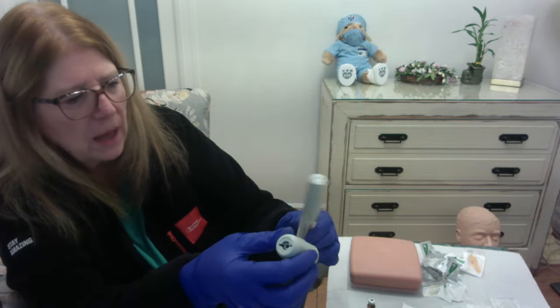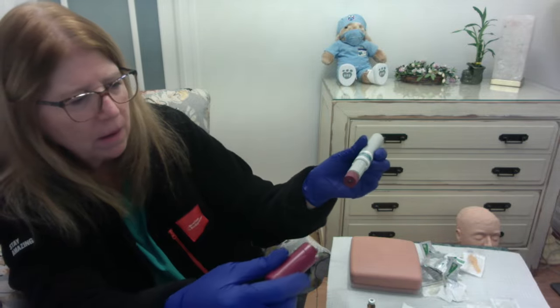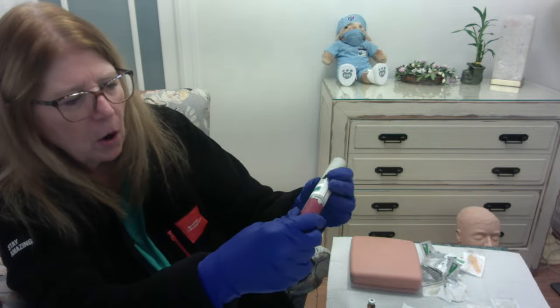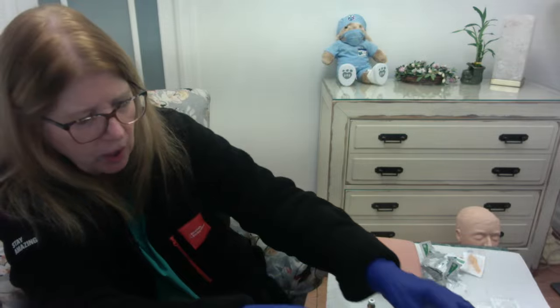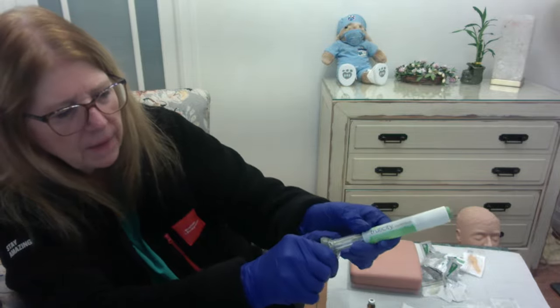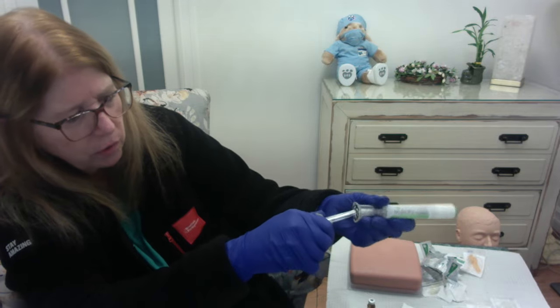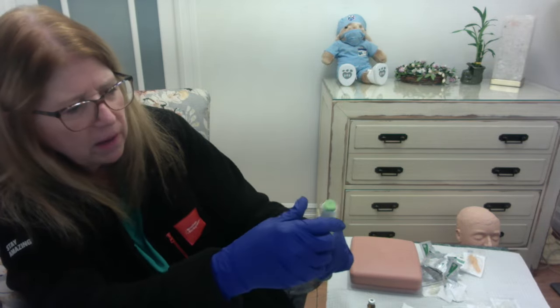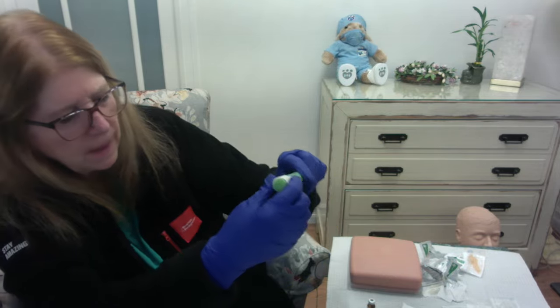There are a lot of these different kinds of pens out on the market. They could be insulin pens, they could be EpiPens, right? There's a medication called Trulicity that is used for our diabetic patients, right? You're going to find that a lot of these pens have dials on them.